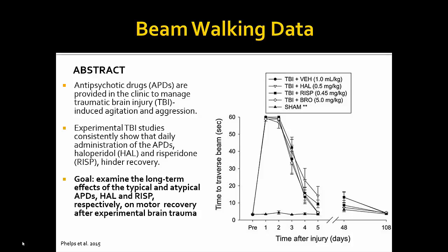So the mice, they remember. I mean, after you treat the animal, they repeat each day, right? Yes. So they remember something they can do better? They should, yes. The idea is that you give them that memory before you do the TBI. So they should have the idea that okay, I'm here and I need to go over here. And you should do that prior to any kind of treatment.